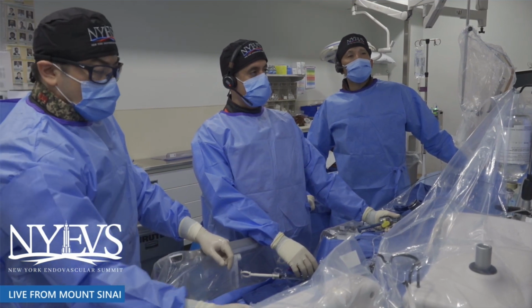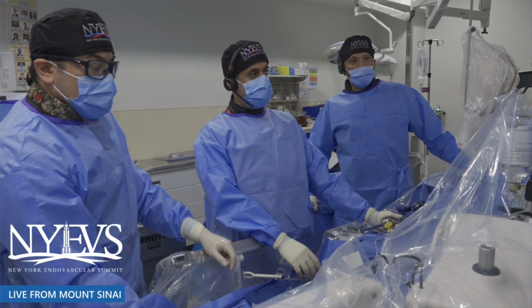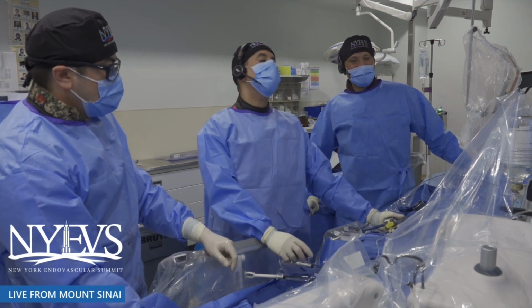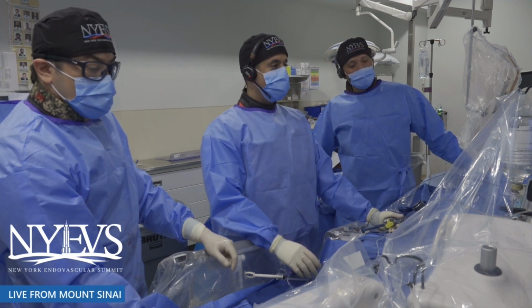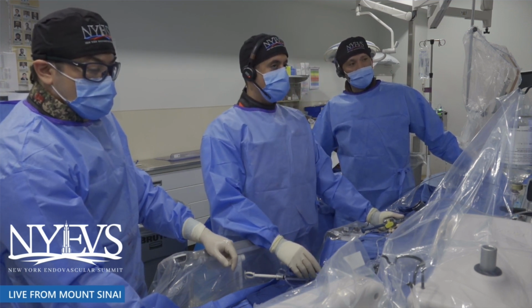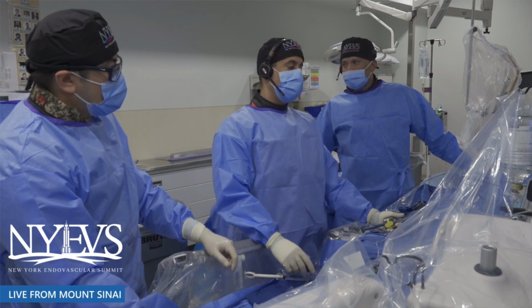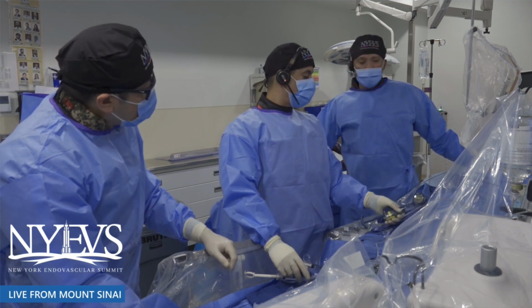lithoplasty balloon. And the other thing is, I think I see PK in the back calling your CFO about using it. So is this an 8 large or just a regular 8 VBX? Regular 8 VBXs. The VBX, if you can go really high on that too, it will expand beyond the reference, so you won't even need anything else. Right. Exactly. That's what we thought.